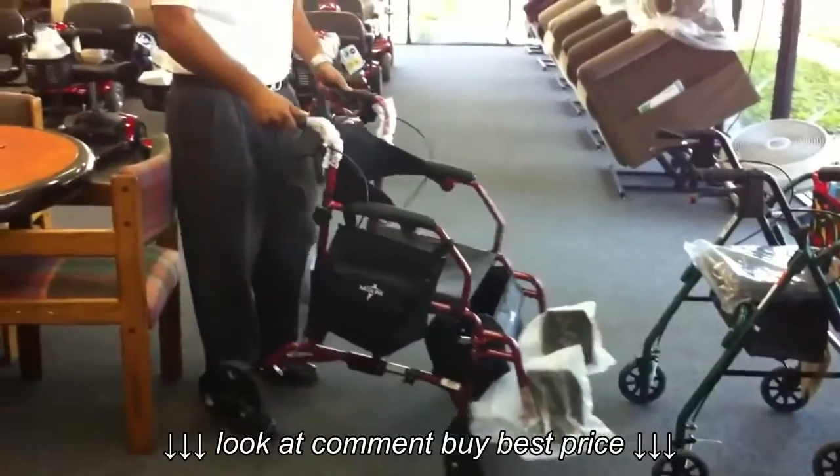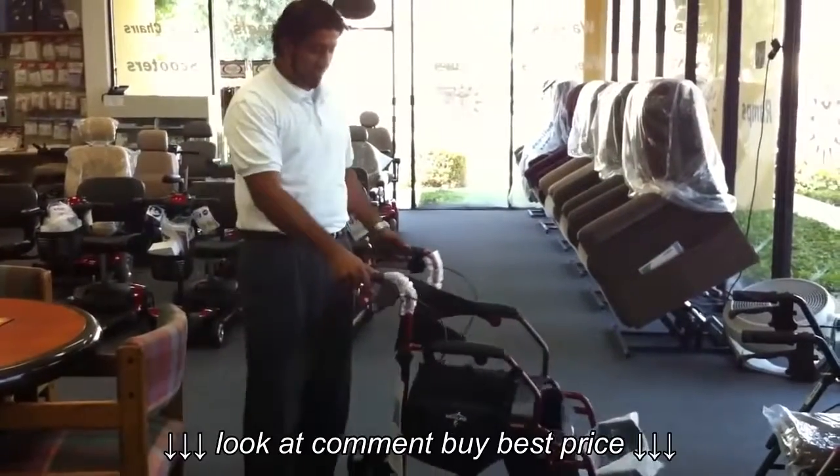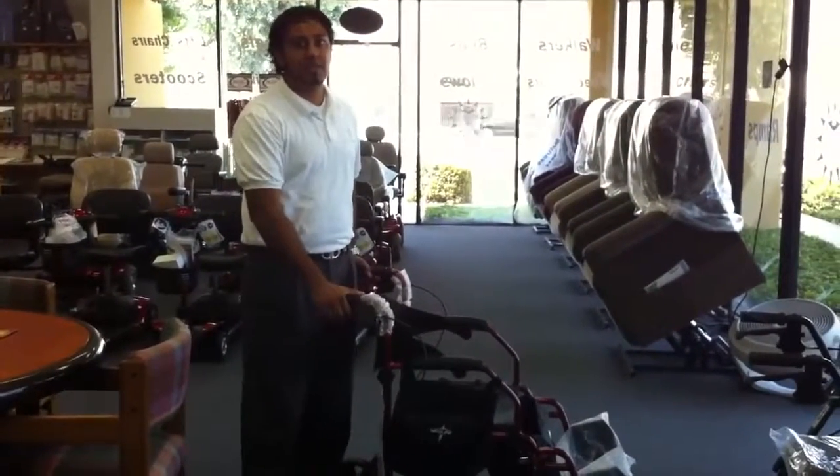So this is the review of the Medline Excel Translator Rollator Combo by Sun Medical Supplies Redlands. For more information, you can check this out on our website, www.sunmedsupplies.com.